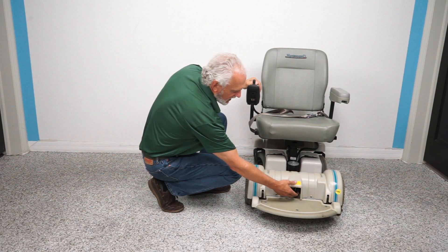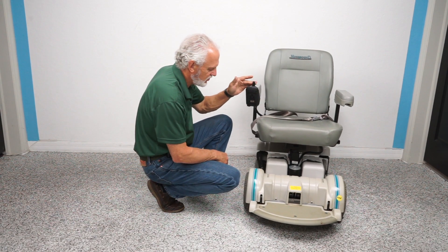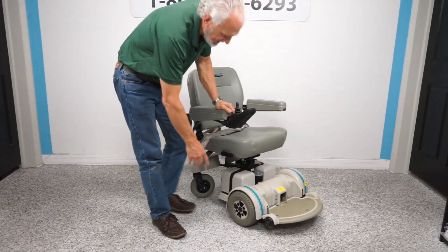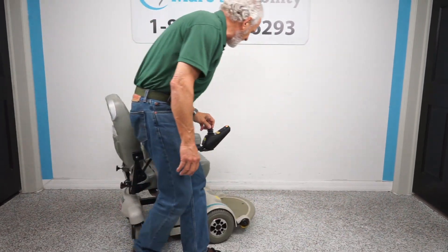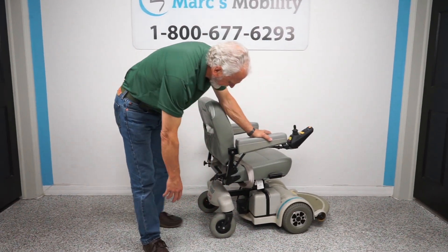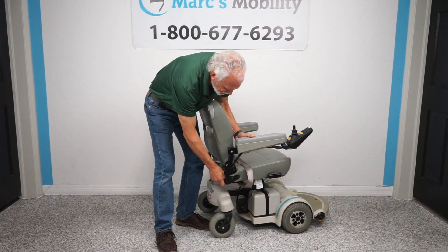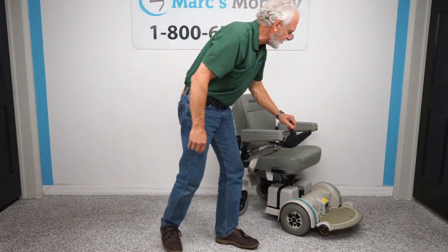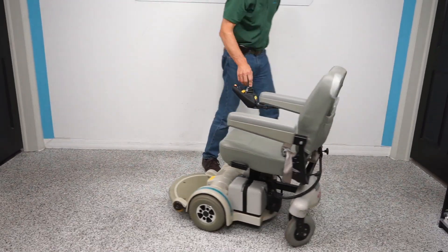When you're done pushing it, turn your power back on and you're ready to go again. The chair has nine-inch air tires on the front and solid tires on the back. There's also a knob here where you would adjust the arm width, as shown earlier.